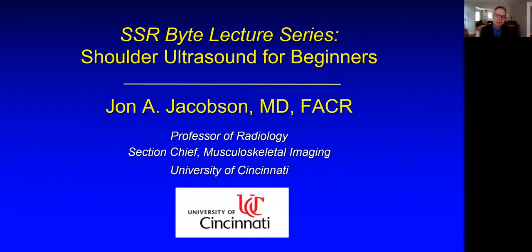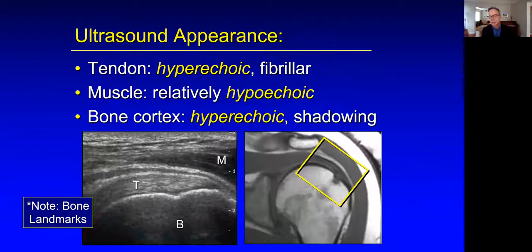Hi, my name is John Jacobson. This SR Byte lecture will be on Introduction to Shoulder Ultrasound. A few comments on what normal structures look like with ultrasound. Tendon is hyperechoic and fibrillar, as shown here listed as T, the supraspinatus tendon.